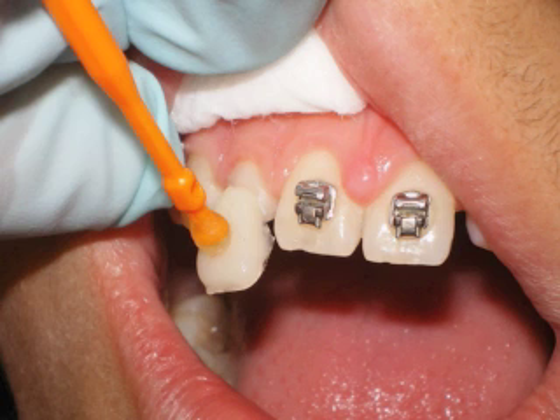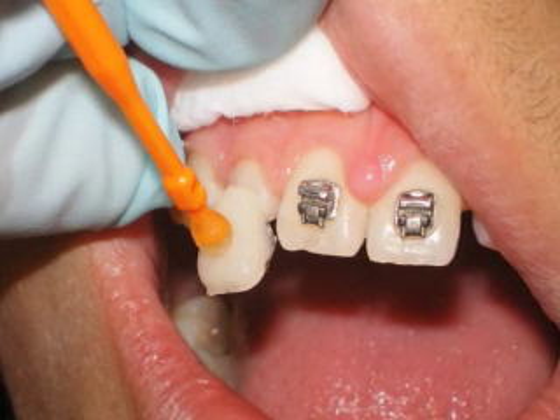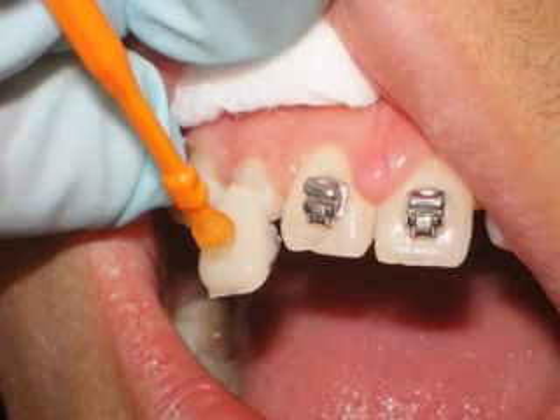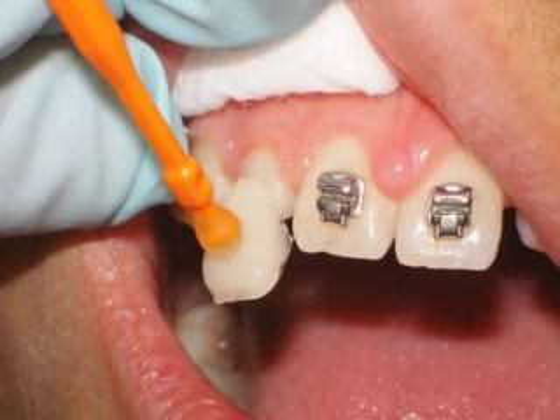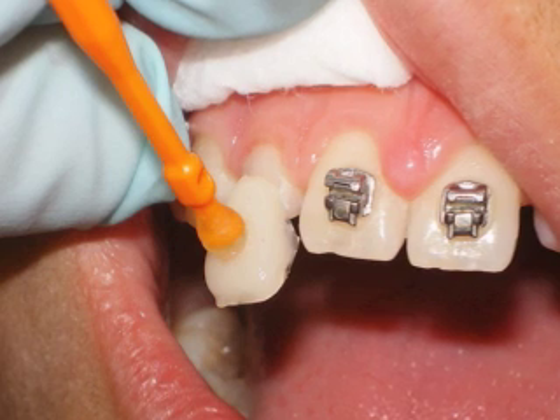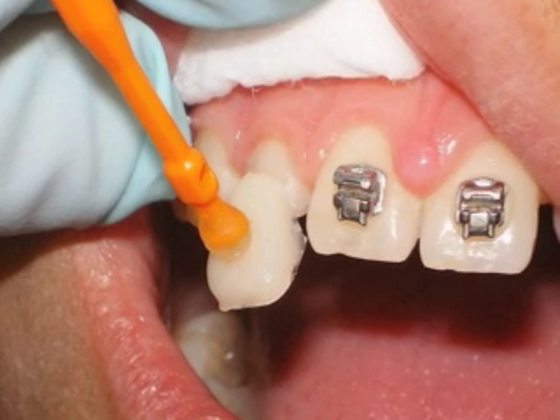I then carry the face-o-form to the tooth and first slide its edge under the gingival sulcus and roll the face-o-form toward the incisal edge. That will ensure that the portion of the sulcus is a nice, cleansable knife edge and not a ledge.